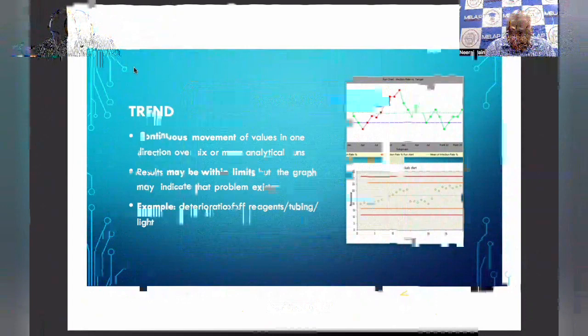But what is important? The lab shall have an effective troubleshooting procedure in place. You have to carry out root cause analysis, you have to take appropriate action, document this, but make only one change at a time and monitor that change for its effectiveness. Otherwise, what may happen?